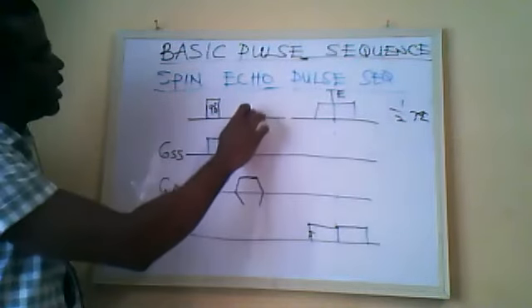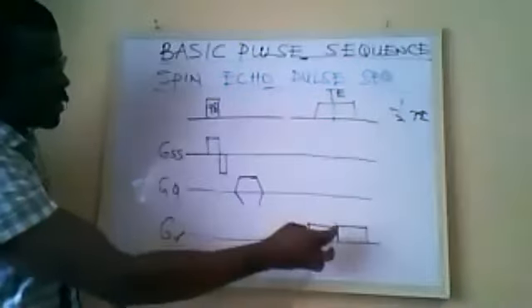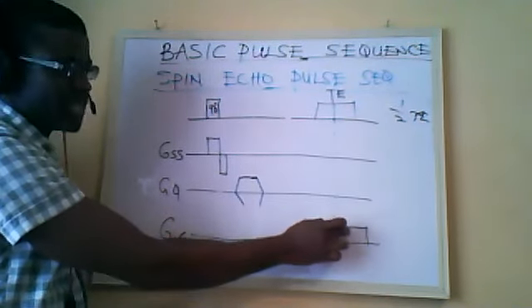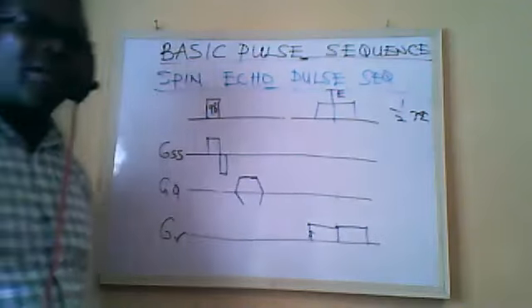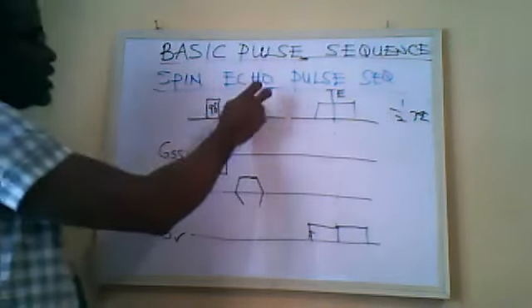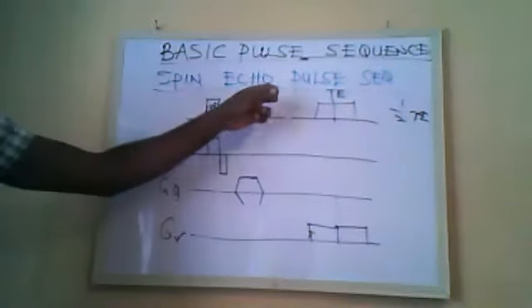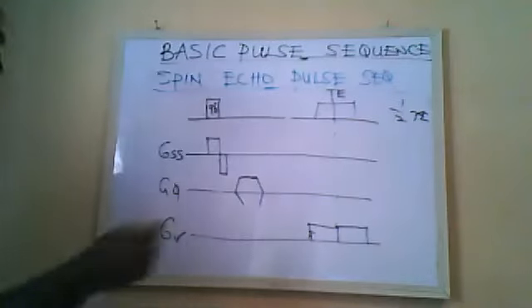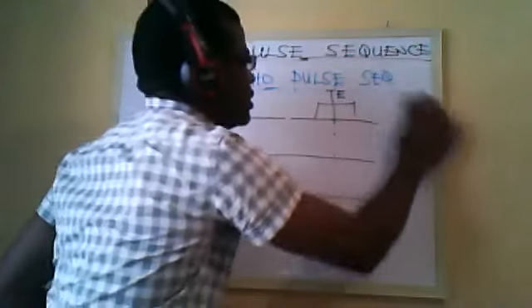Without the 180-degree pulse, we can get our sample here straight off. But the signal here will not be very strong. We won't have a very strong signal. So that is why we need a 180-degree pulse to invert, to introduce what I need to explain here.